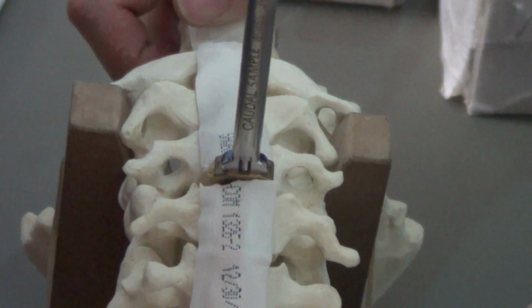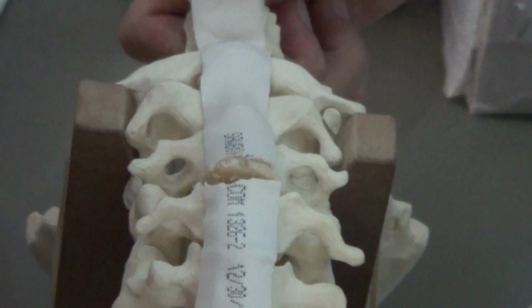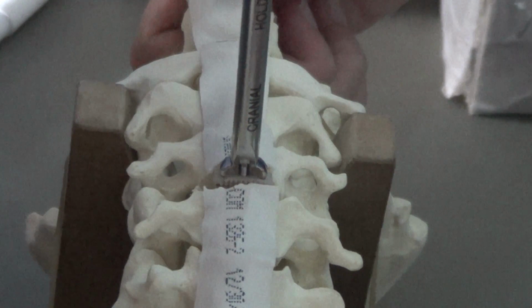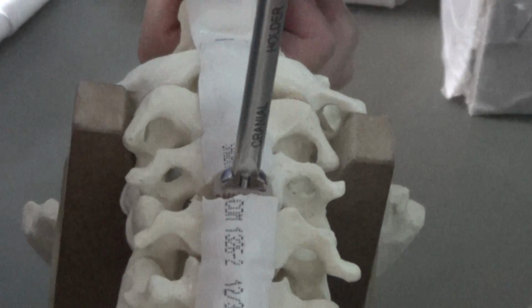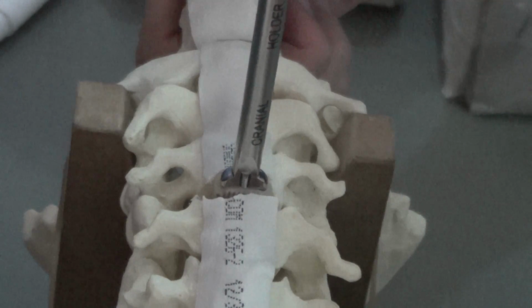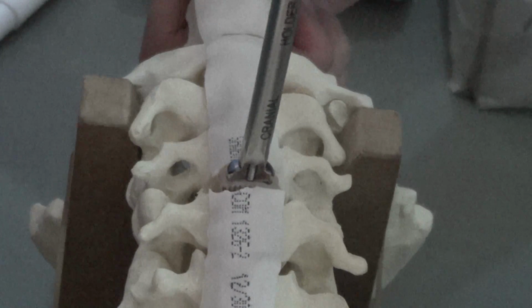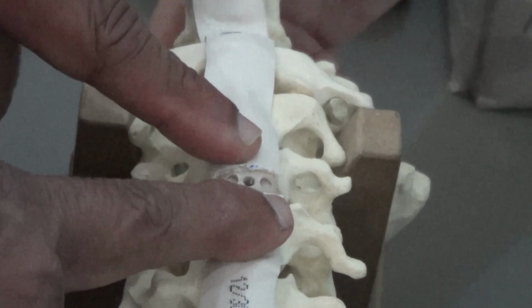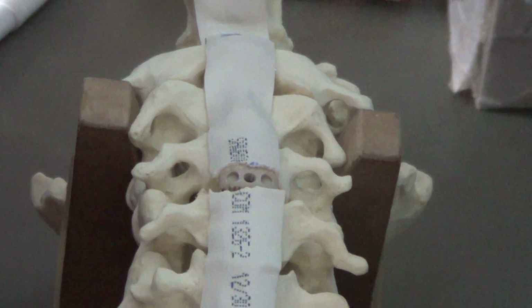What we do, we use a plate in addition to the cage. Once you put this cage with the bone graft and then you remove the pins, you find it's quite stable. But to add in more stability, nowadays we use a plate, an anterior cervical plate.